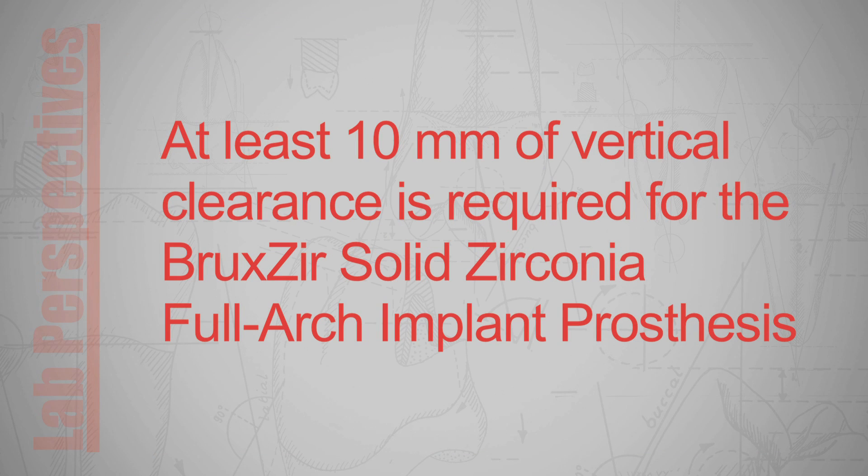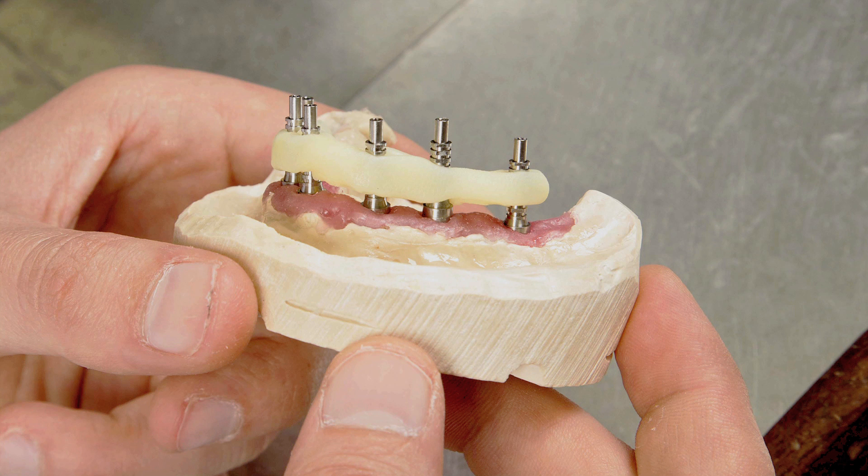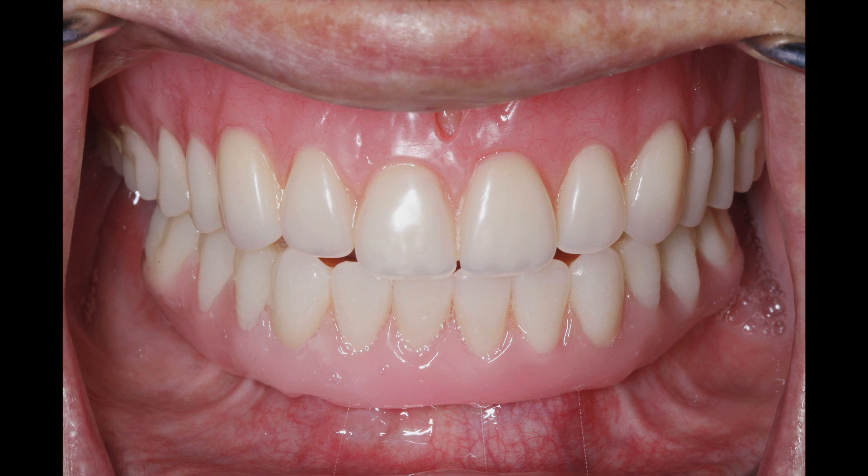Note that at least 10 mm of vertical clearance is required for the Bruxer Solid Zirconia Full Arch Implant Prosthesis. If the implant angulation and vertical clearance are acceptable, the process continues with the fabrication of the implant verification jig, custom tray, and denture setup in wax. The denture setup is used as a preliminary wax try-in for the patient and doctor to assess the function and aesthetics of what will ultimately become the final prosthesis, so meticulous care must be taken to achieve an accurate prototype.